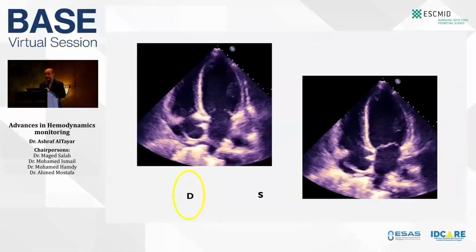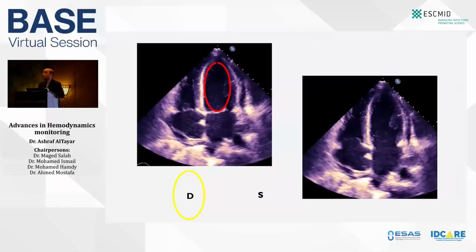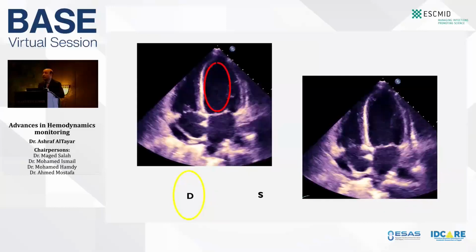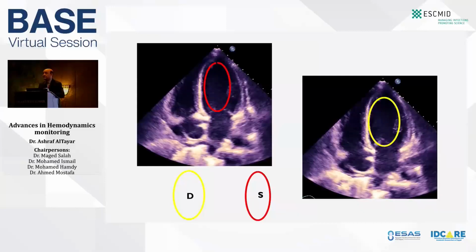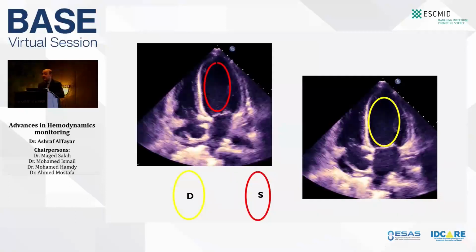There is a lot of evidence nowadays, though small, that when you teach the machine that this is the time of systole, when both walls go approximating toward each other, and when they move away, this is diastole, the machine will automatically delineate the endocardium and tell you the volume during systole was this, and during diastole was this.